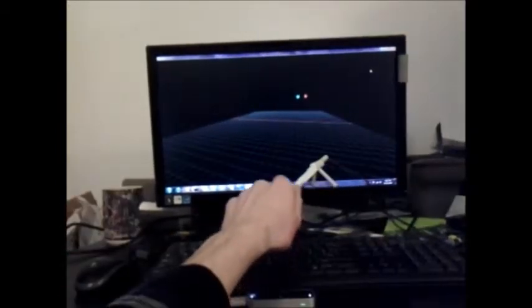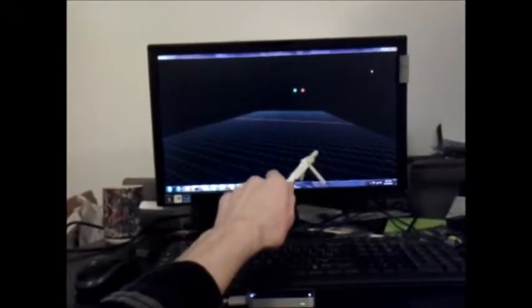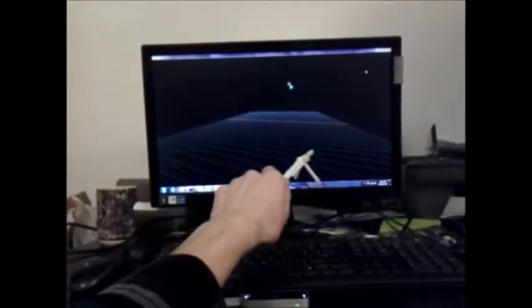This method distinguishes right from left by using the length of the attachments. The attachment on the left is shorter. This method imposes no constraints on where the palm needs to be, but the big downside is that the leap has trouble making accurate predictions about the length of the attachment.